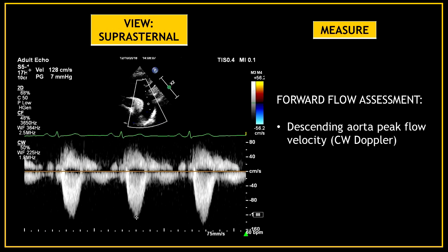Now perform a forward flow assessment. Use continuous wave Doppler on the descending aorta and measure the peak flow velocity.